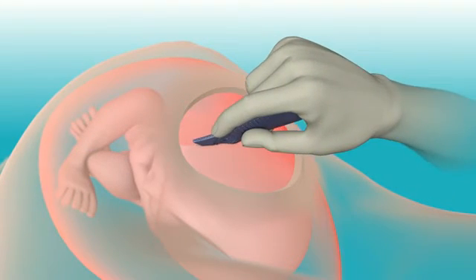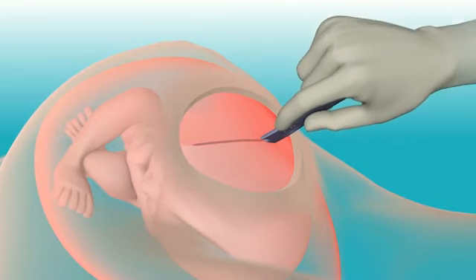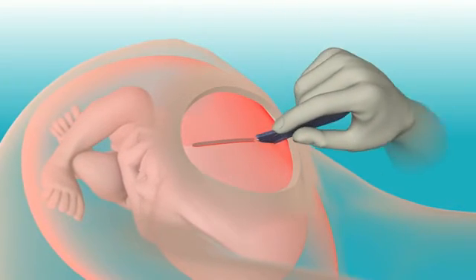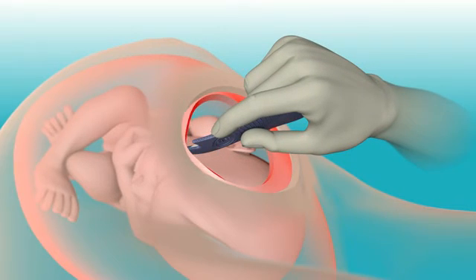If the uterine wall is unlabored or thick, the surgeon can make several C-Safe passes transversely until they can safely puncture into the cavity.